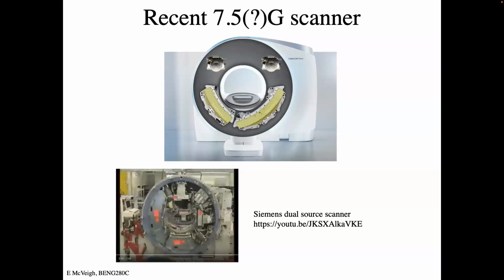And there's usually anywhere from 50 to 100 milliseconds at end systole where the heart is basically motionless, like the motion's within a millimeter or two at any point. So at those 2 points, if you can capture your entire image in either one of those windows, then you will be far less susceptible to motion artifacts, blurring and ghosting and things like that, and streaks from the motion artifact. So that was their idea.